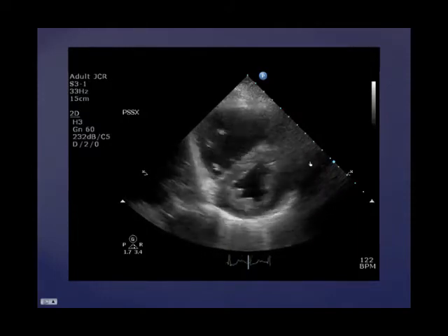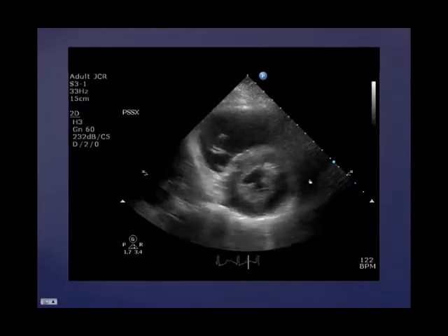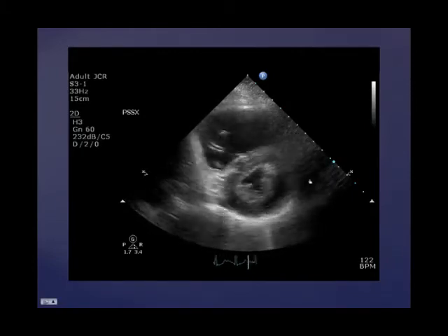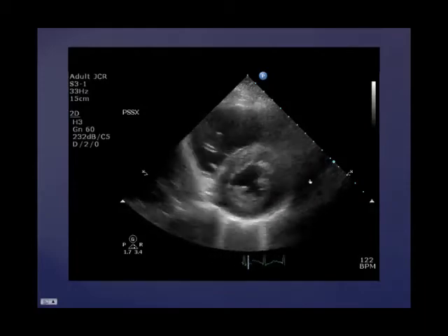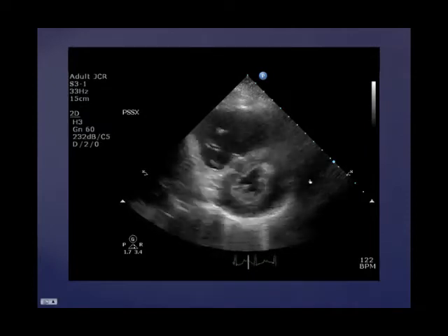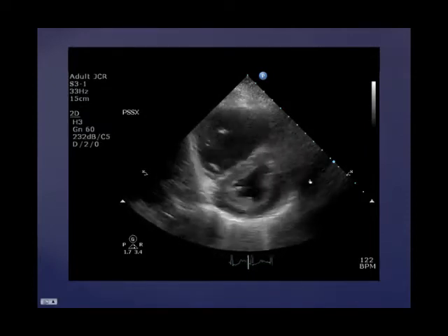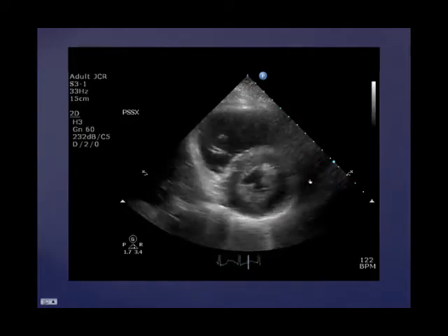You need to concentrate and watch it. When this bit goes in, this bit goes out. And that's because all of a sudden during systole you've built up the left-sided pressures, and that can make the septum actually, the pressure increases and the septum moves out. So paradoxical septal motion.